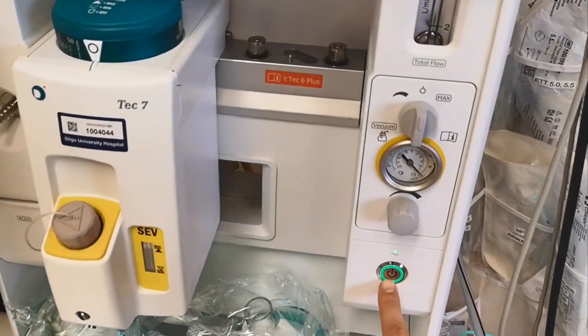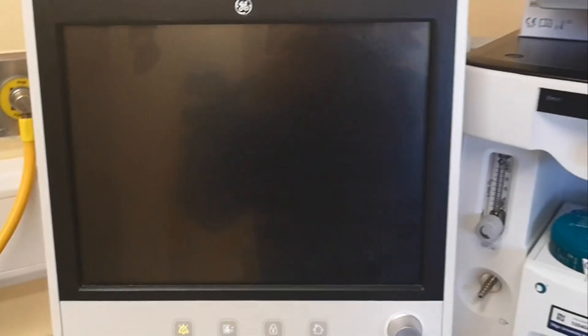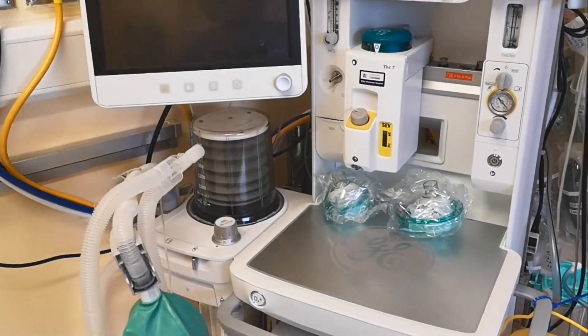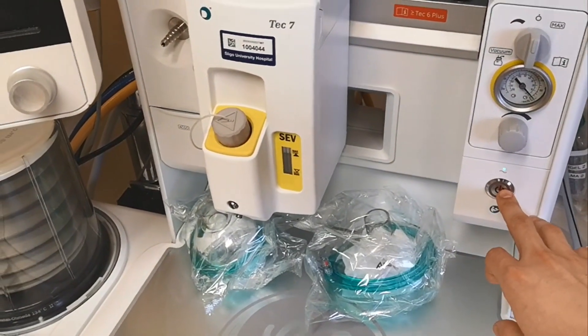This is the switch. Let's switch it off and try to turn it on — press the button here.